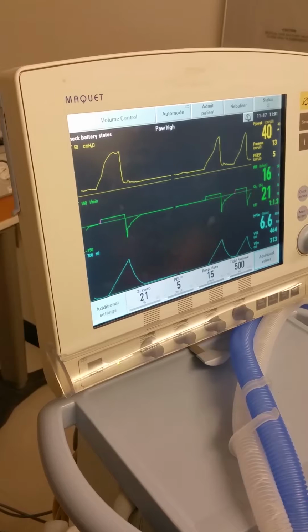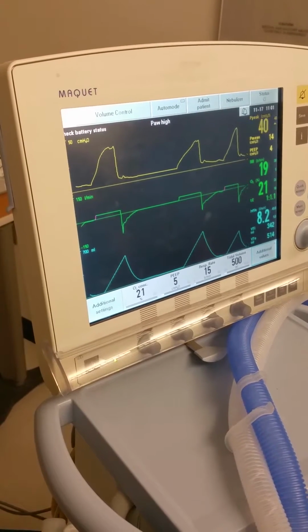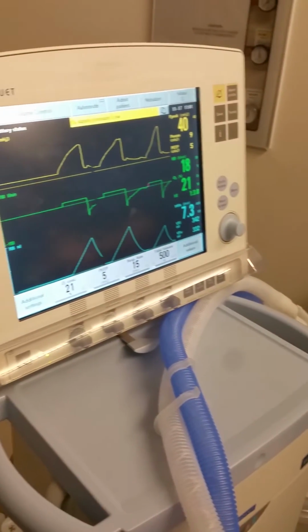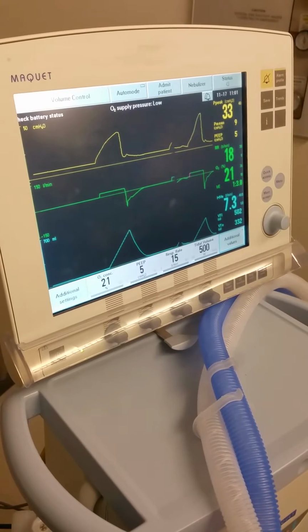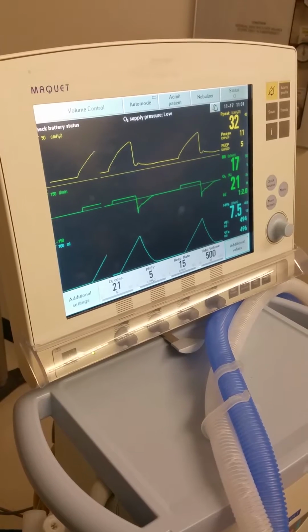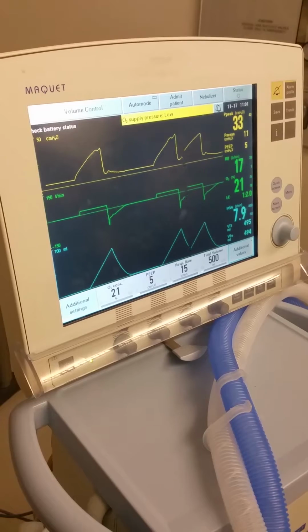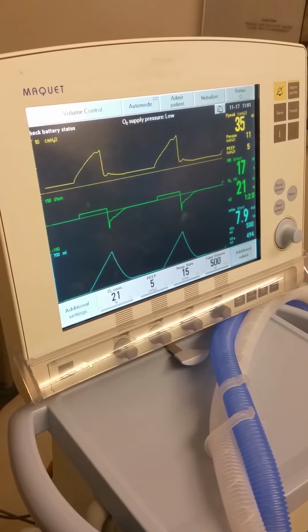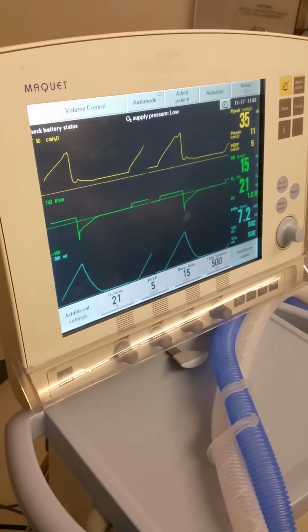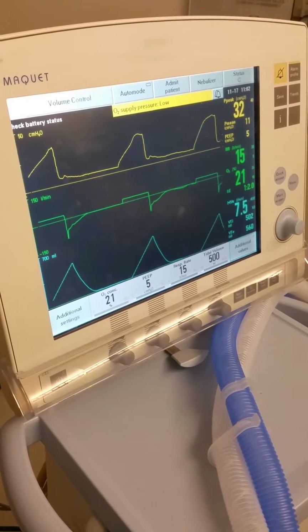But let's say that now the doctor wants to try Bilevel. This patient was in a motor vehicle accident and had a bunch of pulmonary contusions. He looked at his x-ray, and he's starting to see changes. You can even see some bruising on his chest. He hit his steering wheel, so he probably has some leaky capillaries everywhere. So the doctor wants you to go ahead and try Bilevel.